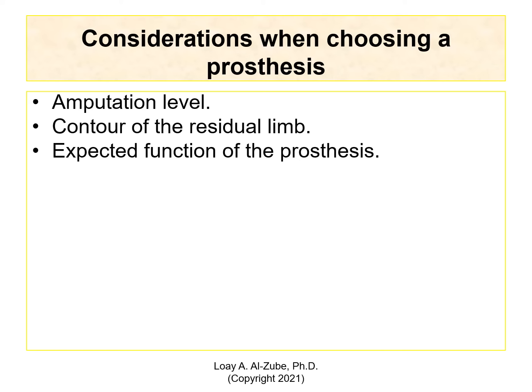Expected function of the prosthesis. What do you want it to do? Do you want it just to do daily activity, or is it going to be experiencing heavy activities like sports?